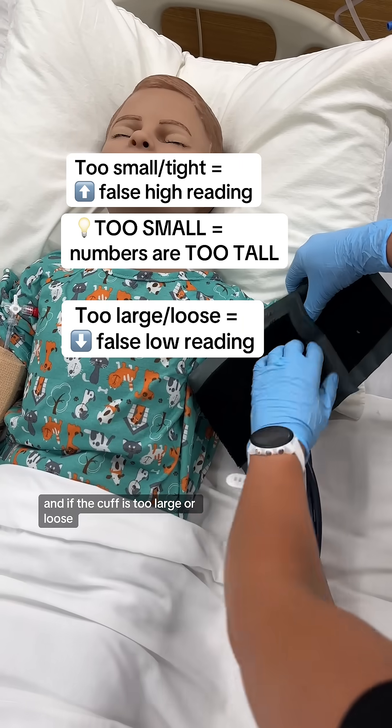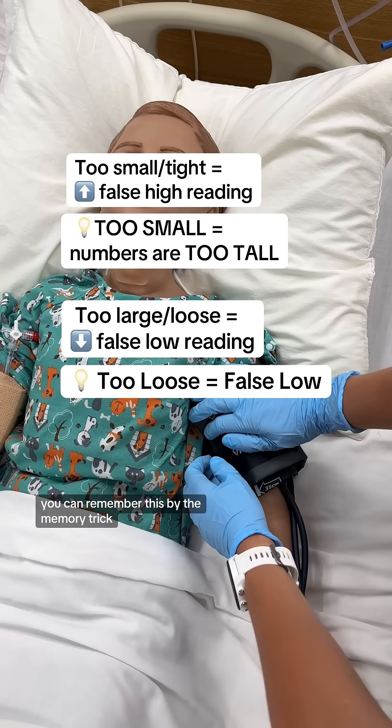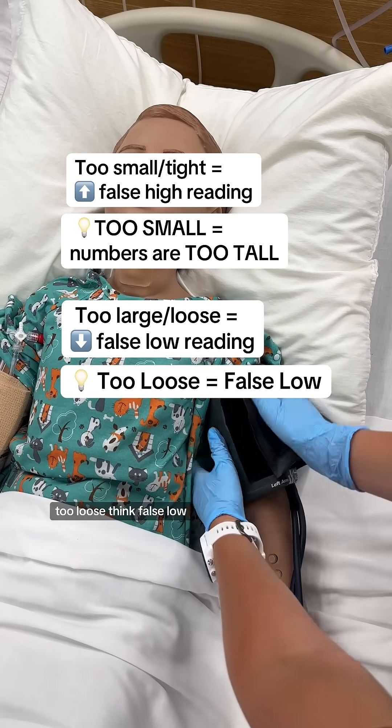And if the cuff is too large or loose, we may get a false low reading. You can remember this by the memory trick: too loose, think false low.